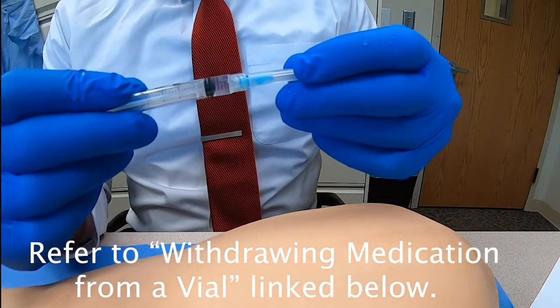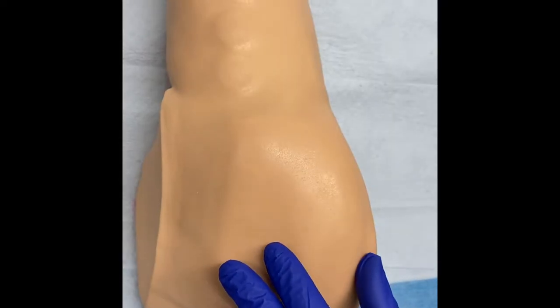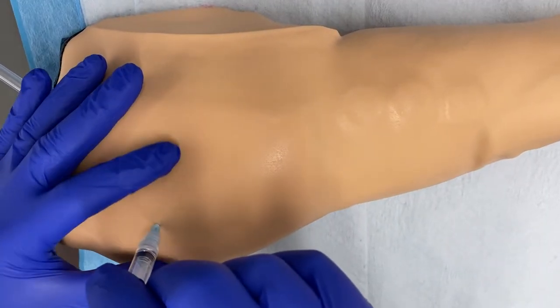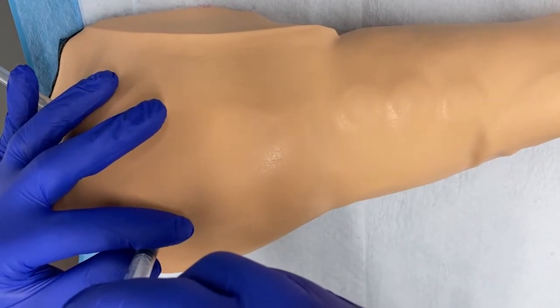For the next step, remove the cap from the needle. You're going to pull the skin taut with a non-dominant hand, then swiftly insert the needle into the area of injection at a 70 to 90 degree angle.